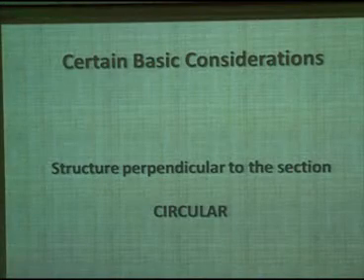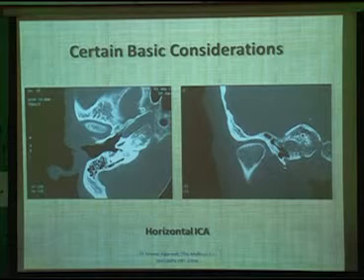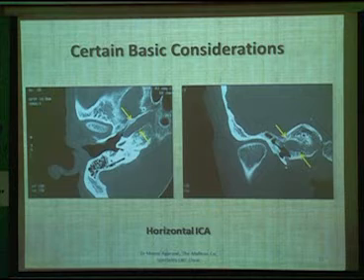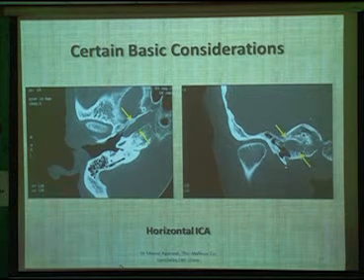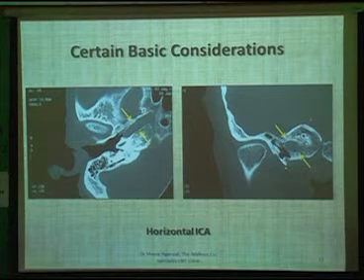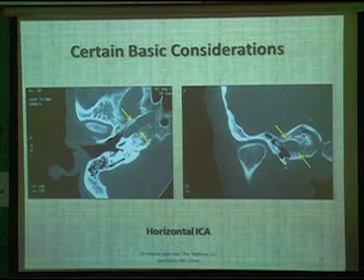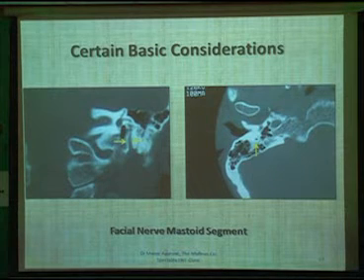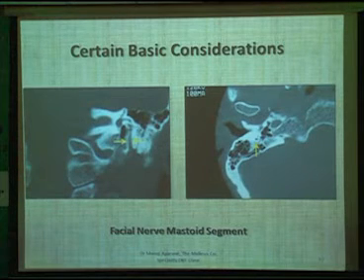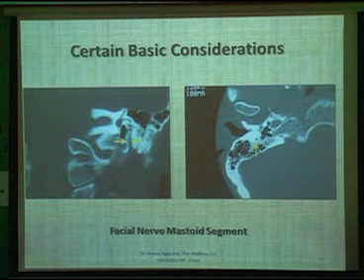Any structure that is parallel to the section will appear in its entirety or as a tubular structure, whereas any structure perpendicular to the axis of the scan will appear circular. For example, the horizontal internal carotid artery, housed in the petrous temporal bone, is parallel to the axial scan and hence appears in its entirety on the axial view, whereas on the coronal section it appears circular because it runs perpendicular to that axis. Similarly, the vertical part of the facial nerve — the mastoid segment — appears in its entirety on the coronal section but becomes circular on the axial scan.